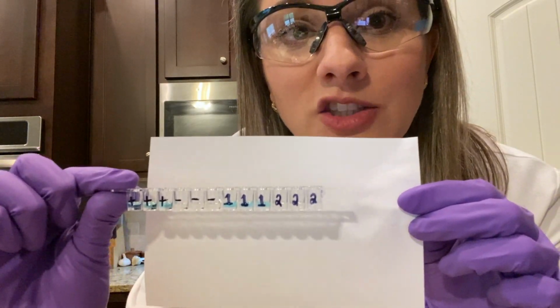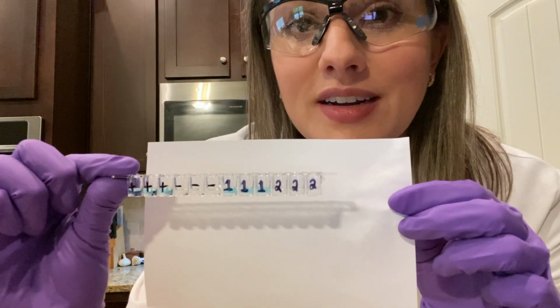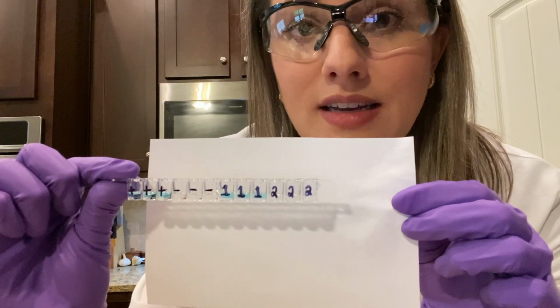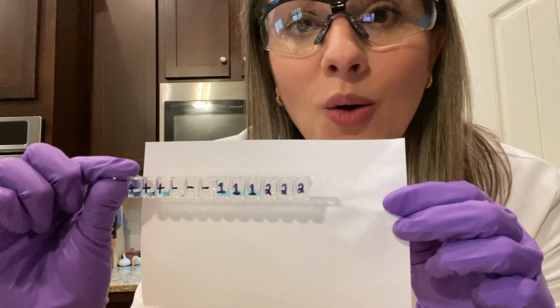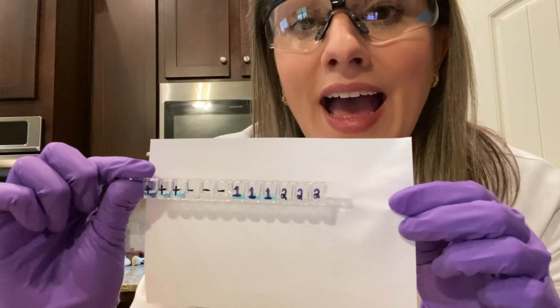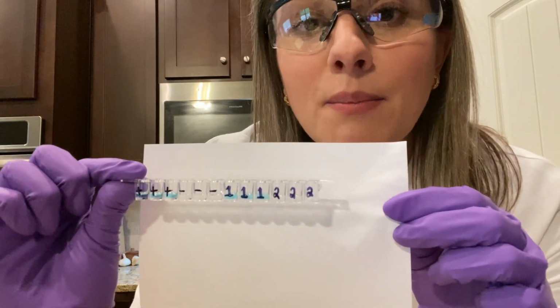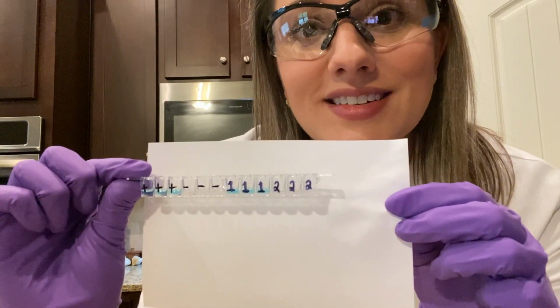Now, if we look at our patient samples, the wells labeled 1 and 2, we're seeing two different stories. So for patient number 1, their results matched our positive control, which means yes, antibodies are present. Versus patient number 2, their results match our negative control, meaning no, there are no antibodies present. So we can conclude that patient number 1 has been exposed to the pathogen because the only way their body is going to produce those antibodies is if they've been infected. Patient number 2 has not been exposed to the pathogen because they don't have any antibodies present.